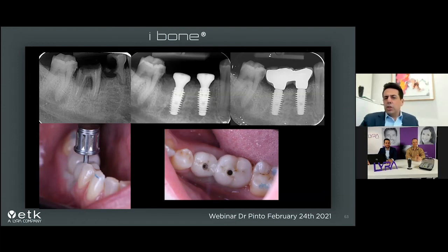The technician chose a very short neck of the abutment. I think it's too short for the biologic width, and it was better to ask the technician to take exactly the same diameter as the healing abutment. But my correspondent, my friend, didn't know that from the beginning. So that's why we see on the left side the pressure that we have on the gum. So we need to take care of this situation. I hope the situation will go well.